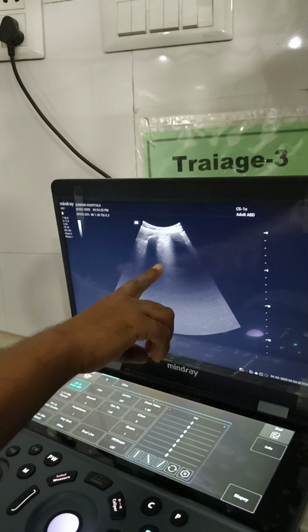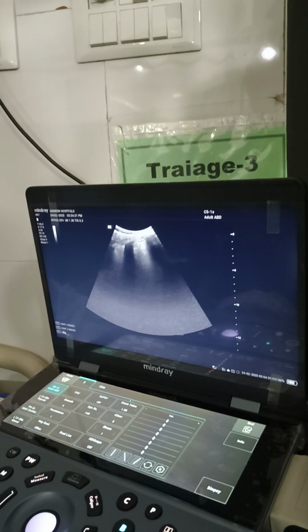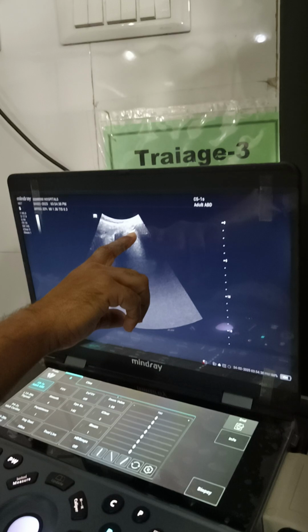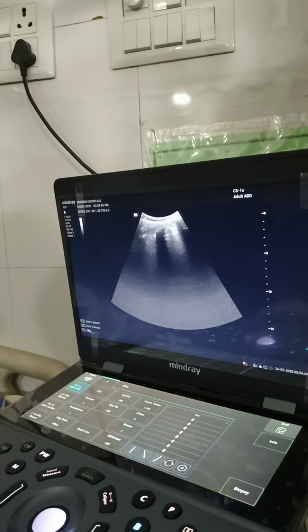here, this is the lung ultrasound using the curvilinear probe on the suspected side of pneumothorax. Here we don't appreciate those B lines, and you see this bright line is static. It does not seem to move with breath.